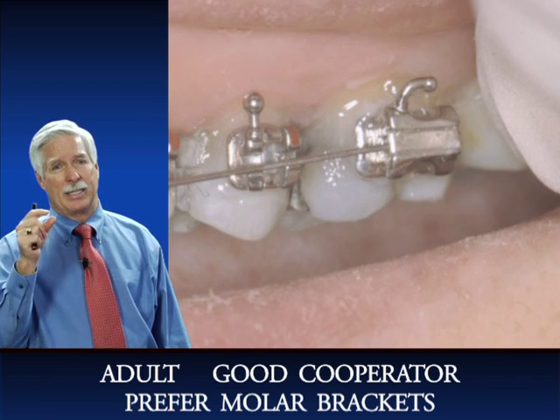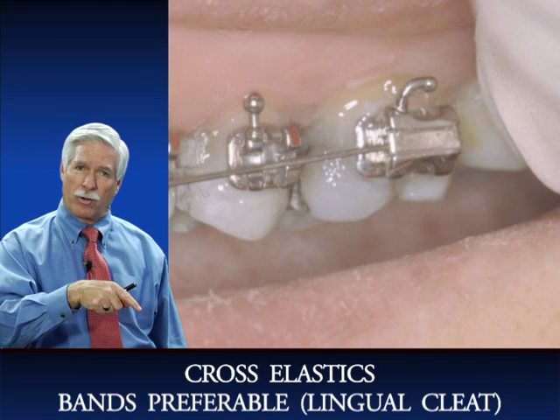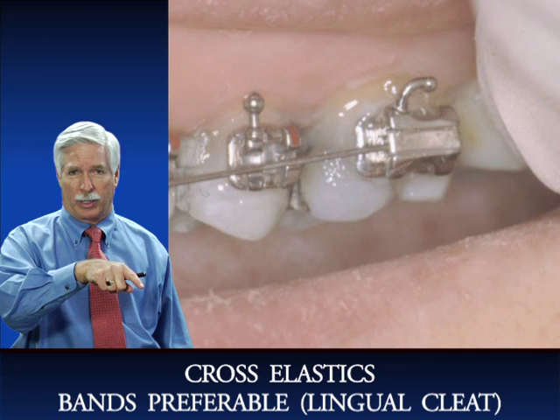But the bands obviously stay on better. And if you're going to be using cross elastics, of course, your advantage is to use a band because they've got the lingual cleats on the lingual.